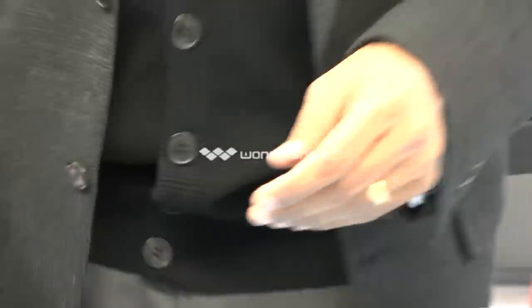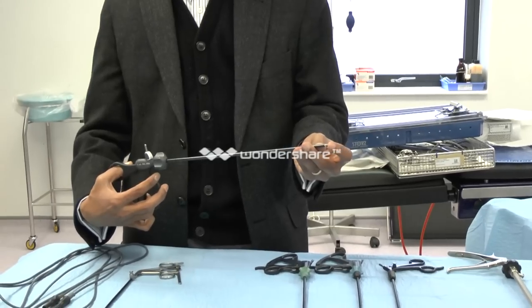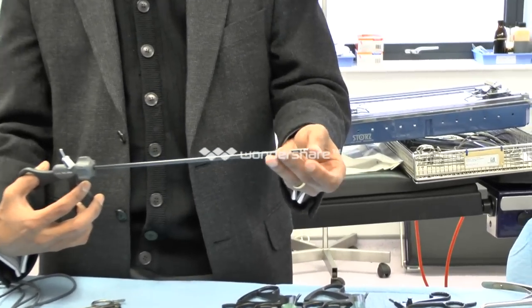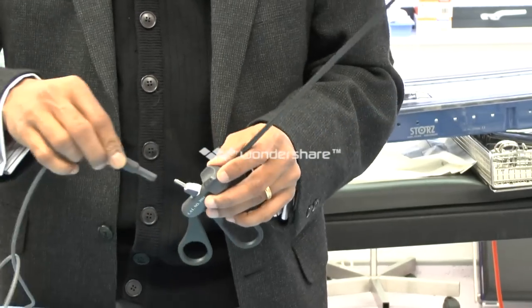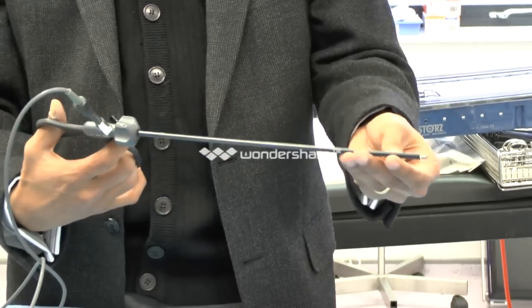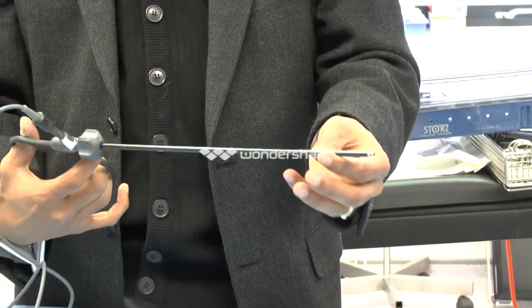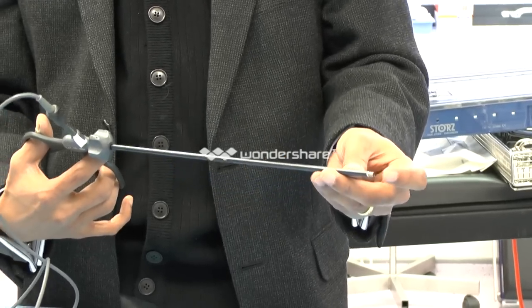This is laparoscopic scissors. In this hospital we use disposable scissor tips, which are single use and are attached to the tip. This can be connected to monopolar cautery, which allows you to deliver monopolar current — either cutting current or blended coagulating current.